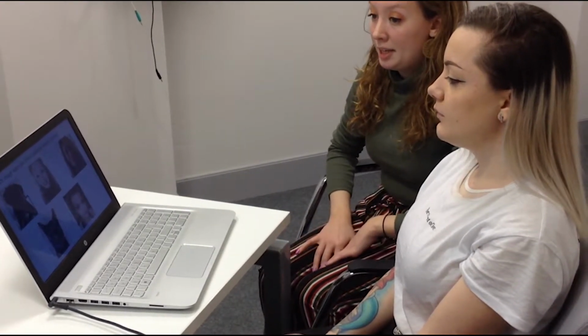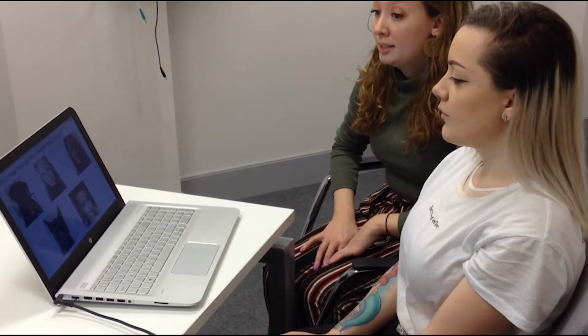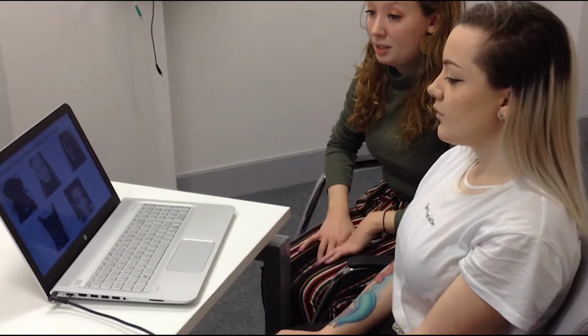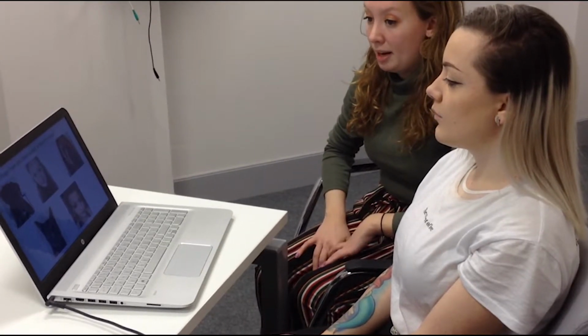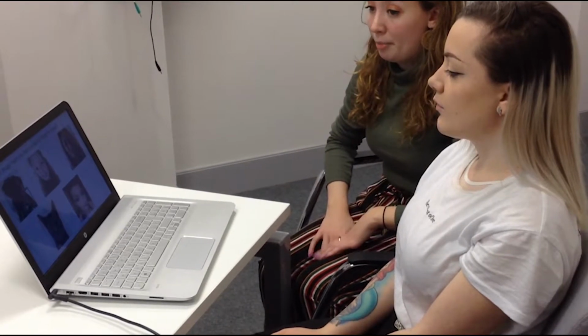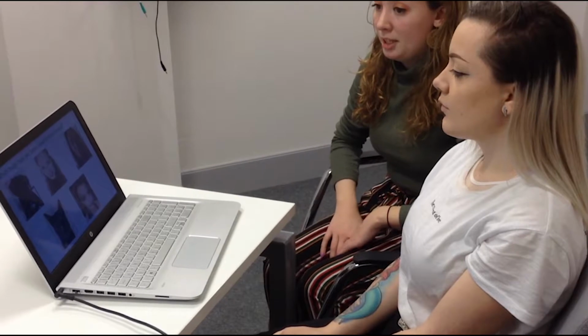Once given an image to keep in mind, the participant will be asked to identify which number correlates to the image they have been asked to remember. This ensures that they've paid attention to the relevant stimuli, ensuring the researcher can access when the participant is presented with their relevant image. This process of having a relevant image to remember will be repeated with each image, aside from the oddball pet images.